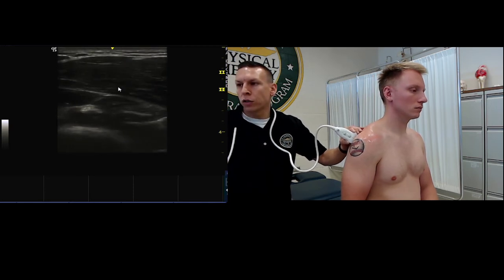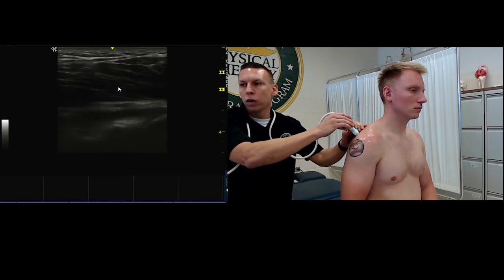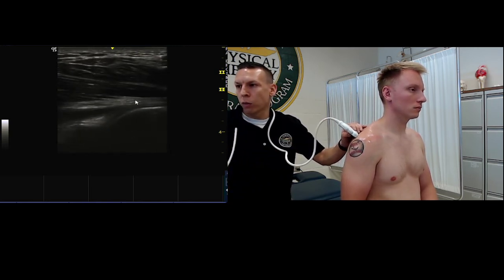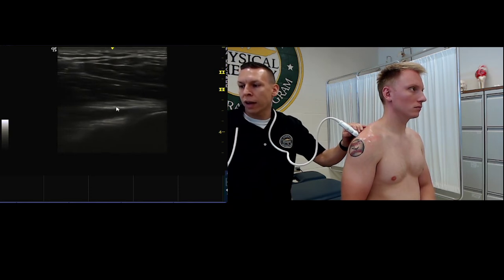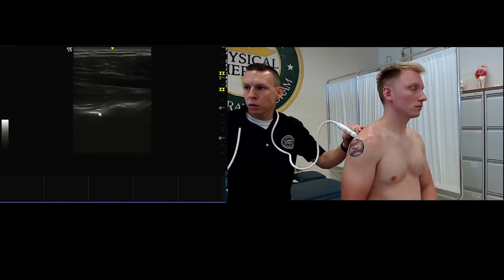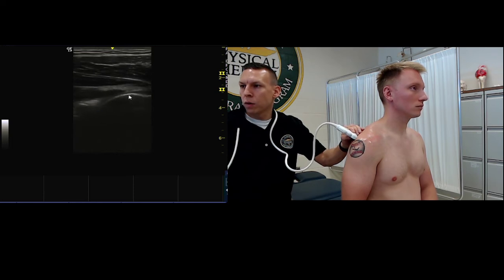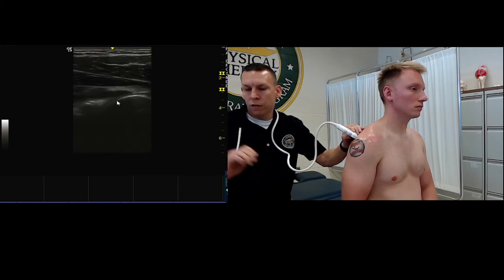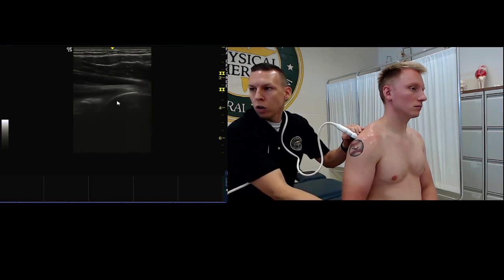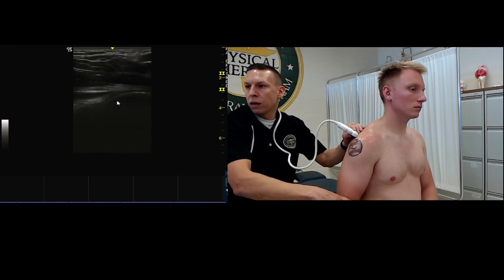While we're here in the posterior shoulder, we want to look at the posterior glenohumeral joint. So we're going to turn our probe again, almost like we're looking at the infraspinatus in long axis. We're probably going to change our depth to see deeper, so we can see the humerus here and glenoid. You almost can see the suprascapular notch and nerve. But here is where we want to see the glenoid. Here's the labrum. This is the humerus. If you're having a hard time, again, you can just rotate the humerus around and look at that joint move.